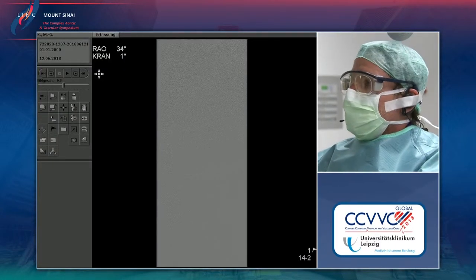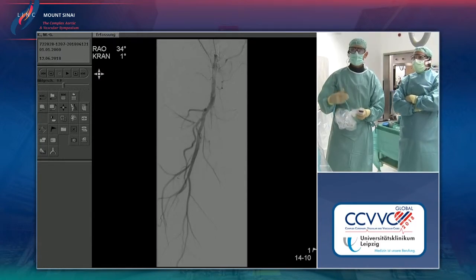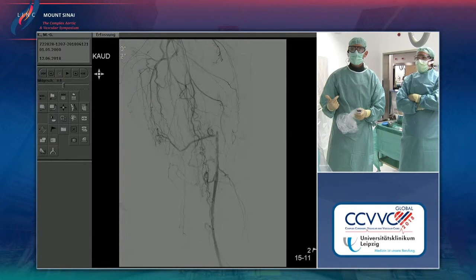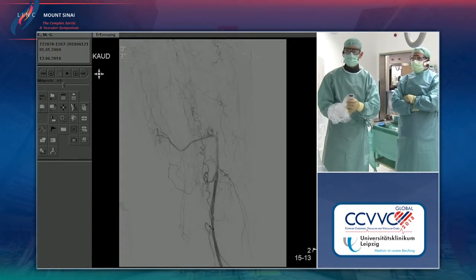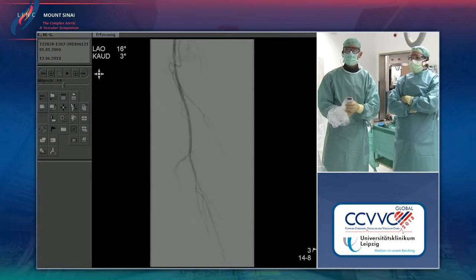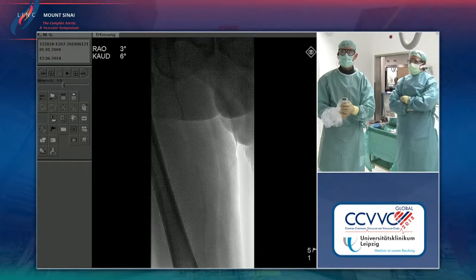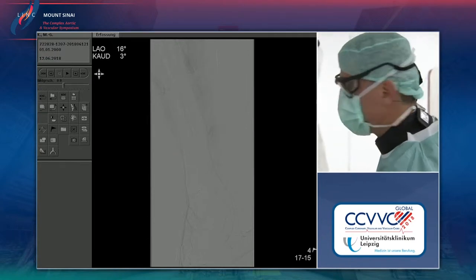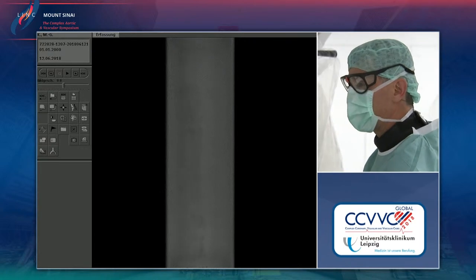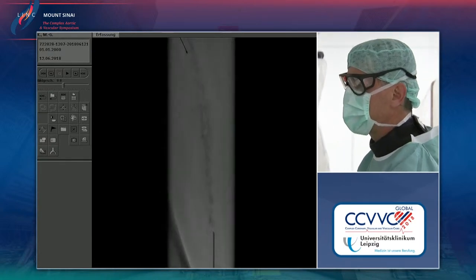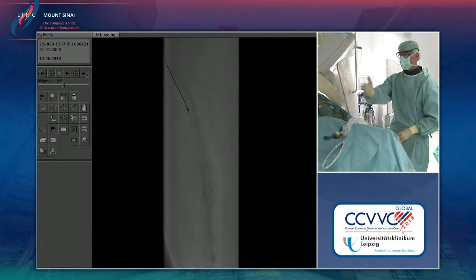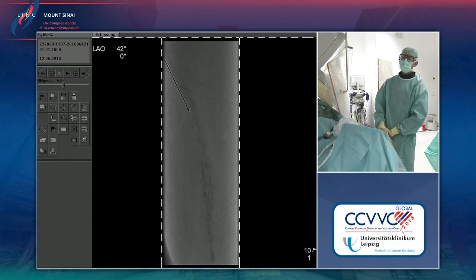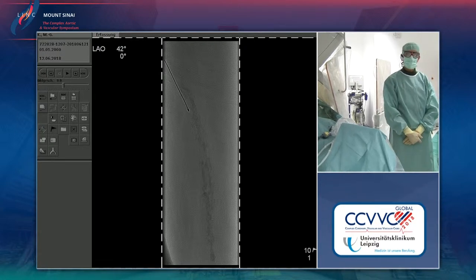As Sven said, we went crossover with the seven French sheath to this occlusion. You can see that the proximal channel is also actually occluded and further down here you can see the distal SFA. Further down there are actually all three arteries open. The calcification is really significant — we went already down with the wire and were also stuck here, where they couldn't re-enter in the other hospital either. Seeing this, I think this is a clear-cut case for a Supera stent.